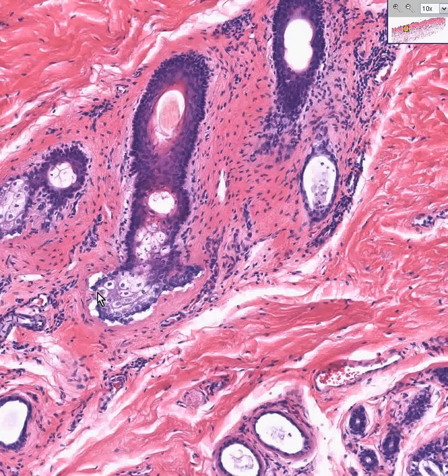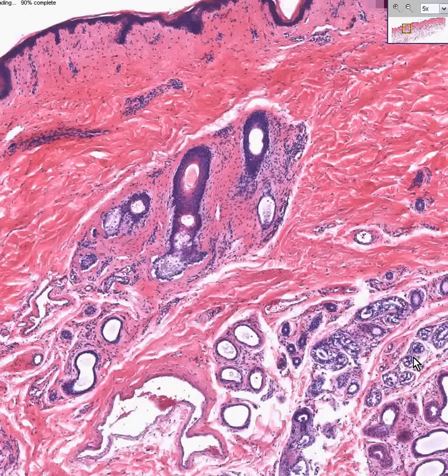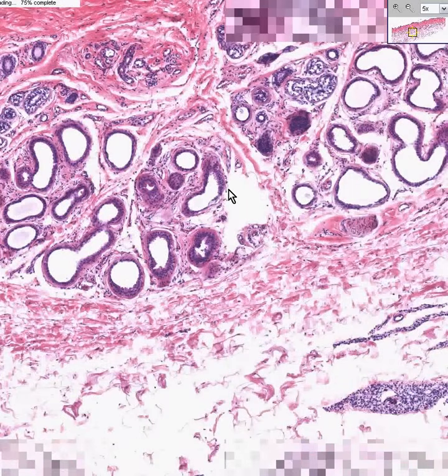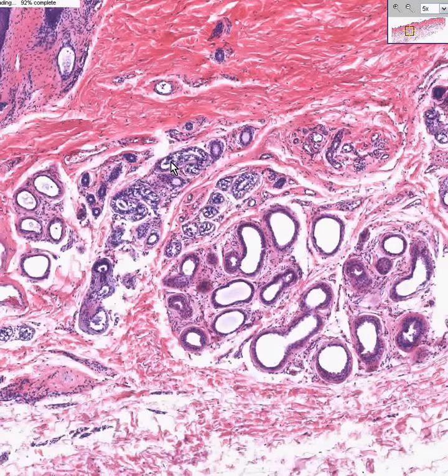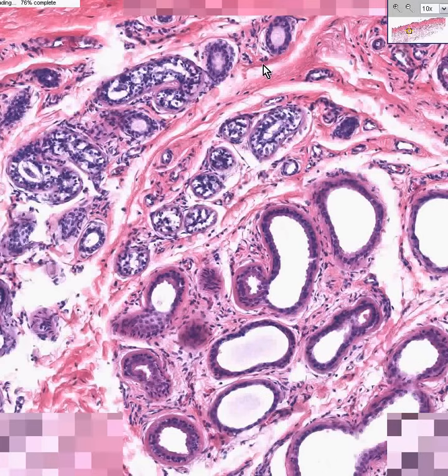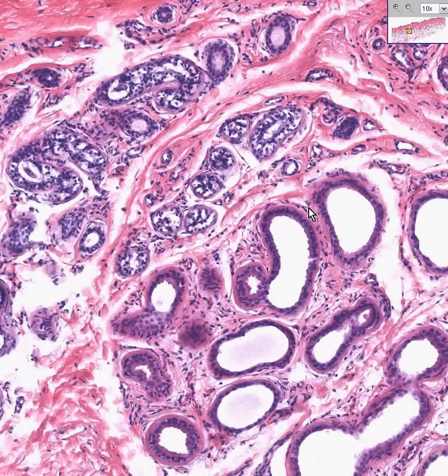And you can see that in contrast, these are sheets of cells, whereas the clear cells with foamy cytoplasm that we see in the eccrine sweat glands, they look a little bit clear as well, but they are always very tubular, and they do not form sheets like we can see here. This is a classical group of eccrine acini right above a classical apocrine type of sweat gland. And that's all I wanted to say. I think we have pretty much finished with skin.